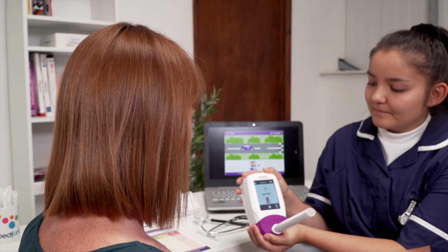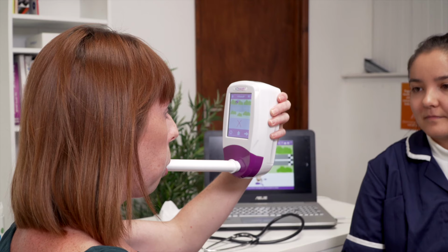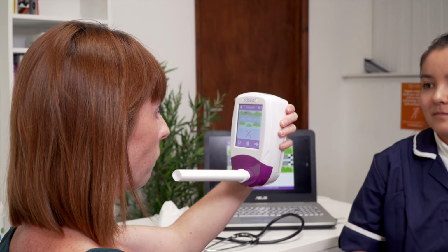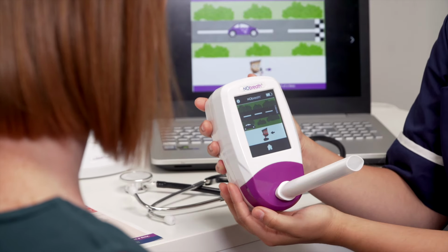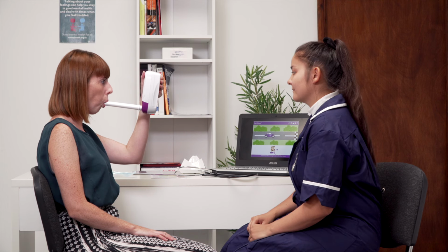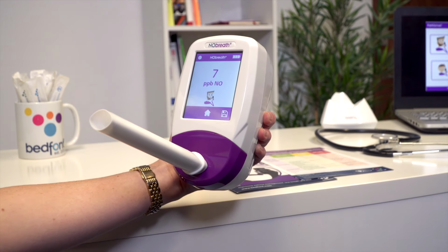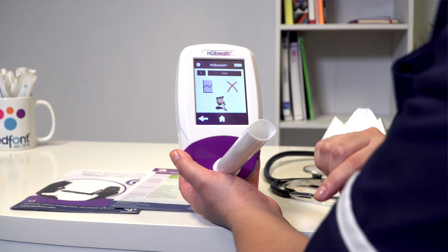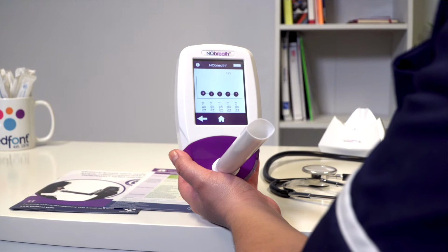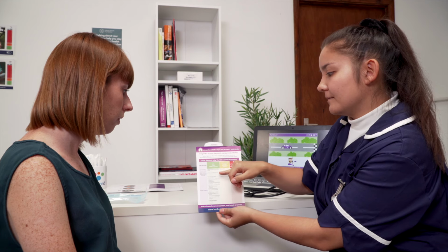If you blow outside of the exhalation guidelines, the test will beep, signifying a fail, and a red cross will appear. Either press the retry icon to take the test again, or the next icon to view the results anyway. You can press the home icon to return to the main screen, or you can save this result by pressing the save icon. If you choose to save your results, you'll be asked to enter your PIN if you haven't entered it in the last 30 minutes. Select a profile from the list to add your result to, or select an empty slot to set a new one. Readings and results can be interpreted using the NObreath FeNO interpretation chart.